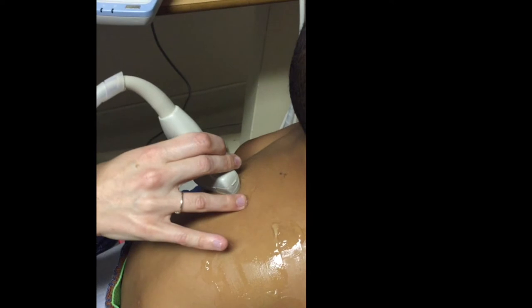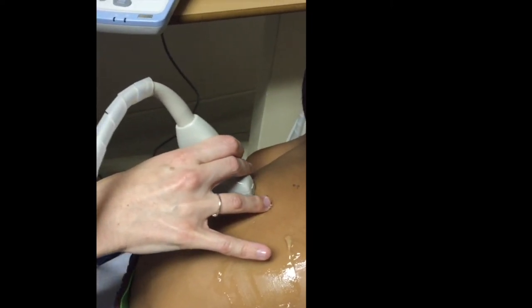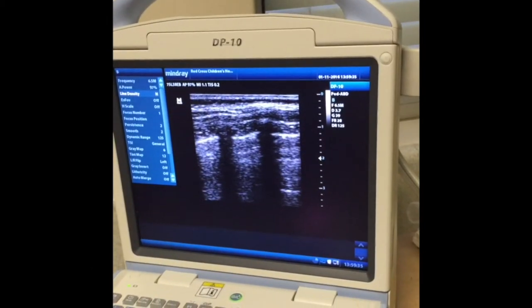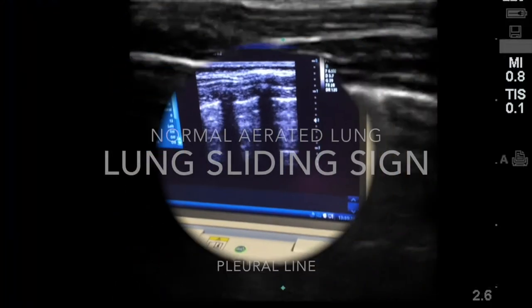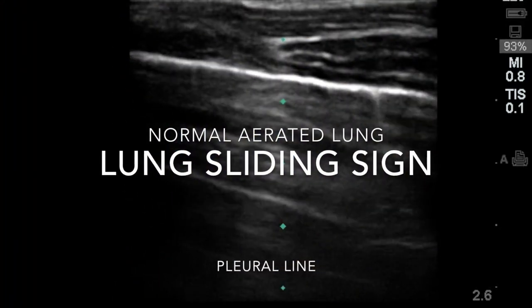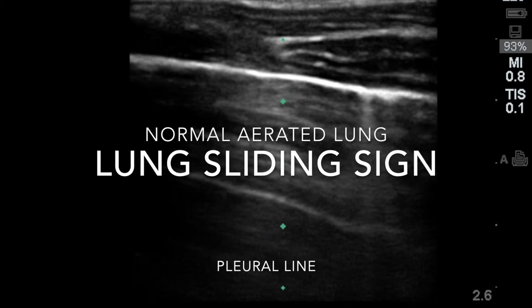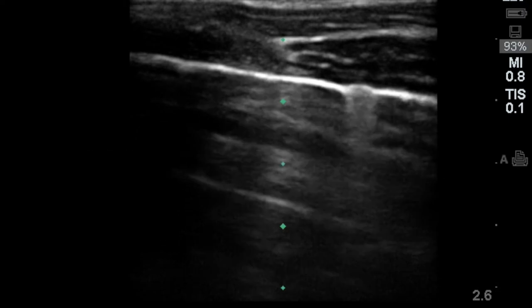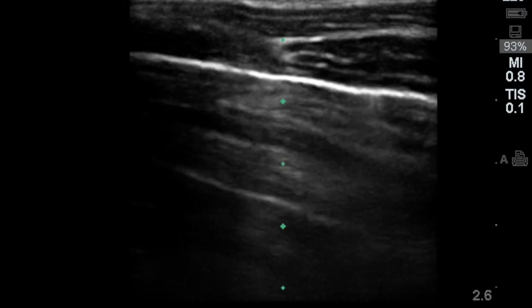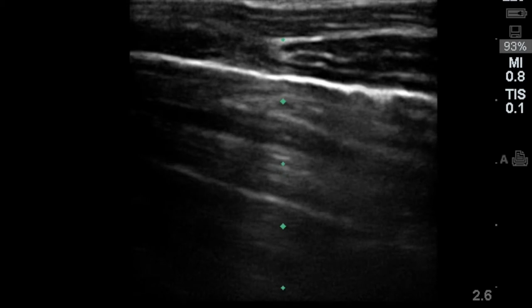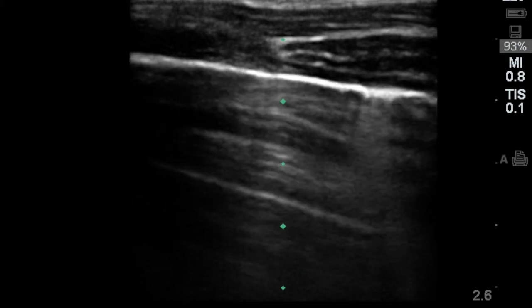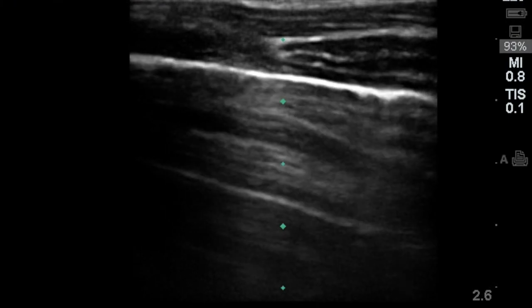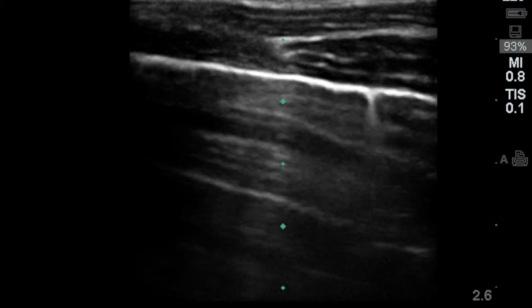One can turn the probe into a longitudinal position, again not very important which is the upper or lower part. One can then demonstrate ribs which help you see where the lung starts. The lung starts immediately deep to the ribs and one can see what we call the lung sliding sign, which is that very bright line which is shimmering on the image — this actually represents the pleural interface. It's very important to identify the pleural line because you know where the lung starts, and it's also important that this line be continuous and intact. An interrupted pleural line is an important sign, particularly when I demonstrate consolidation to you.